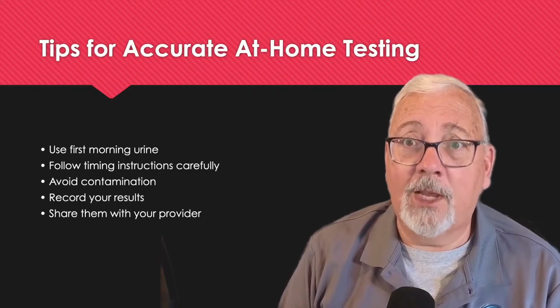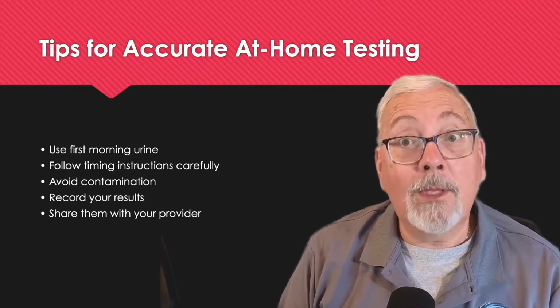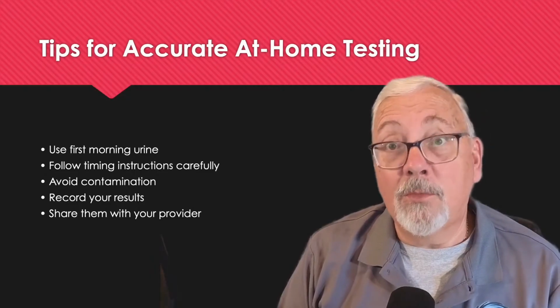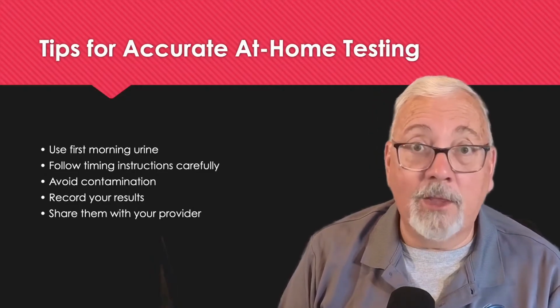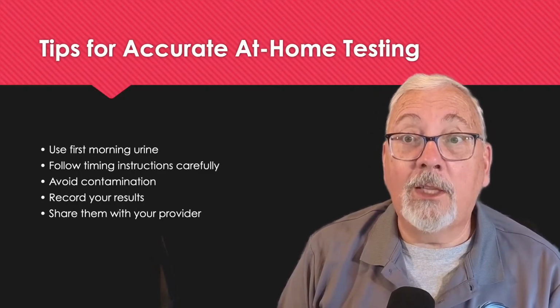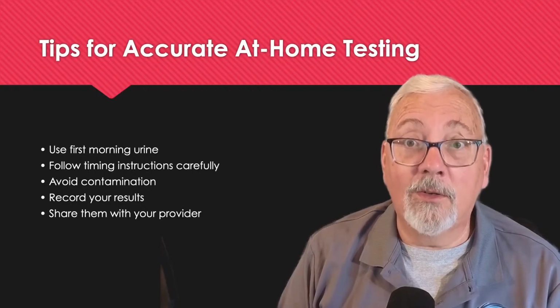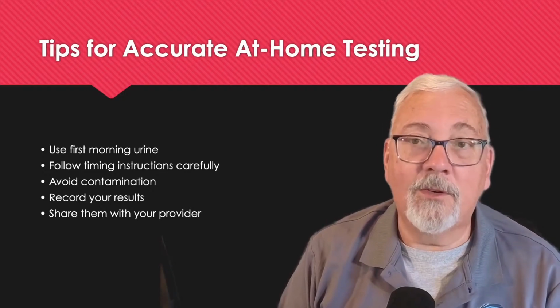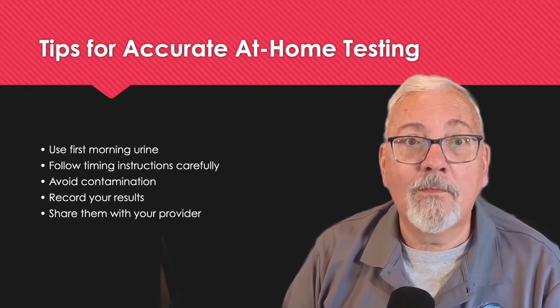So midstream, go a little bit into the toilet first, then catch a sample in the cup for your test. Best time to test generally is first thing in the morning, and that's because your urine's more concentrated from sitting all night long. It increases the likelihood of detecting infection markers. More leukocytes and nitrites in the urine, the easier it is to find it on that test strip.